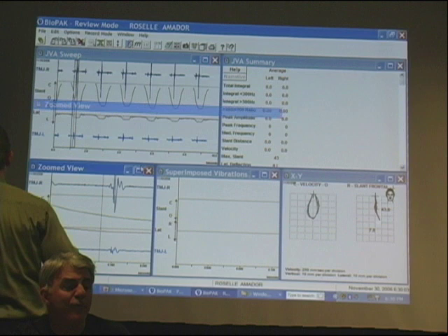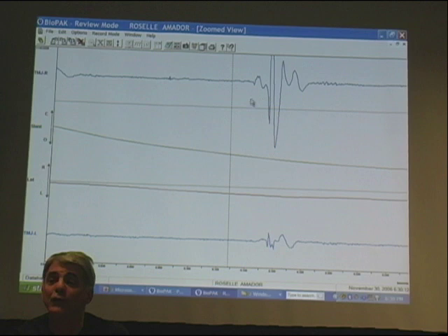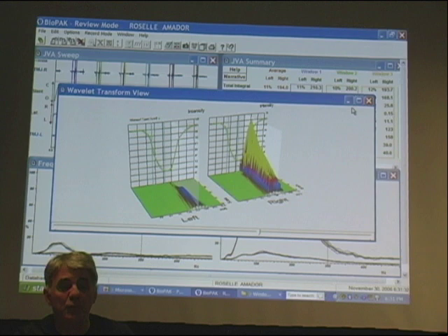And is that waveform consistent with anything? Sure. One, two, three, and in. It looks very much like a disc displacement with reduction. This is a typical disc displacement with reduction, without degenerative joint disease.